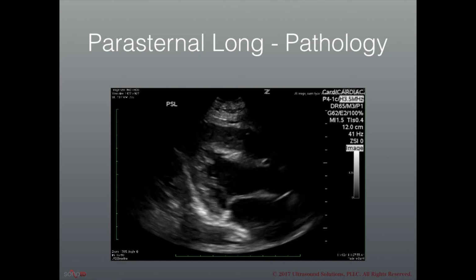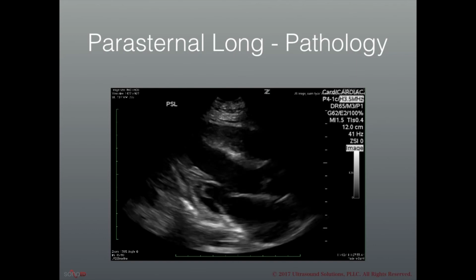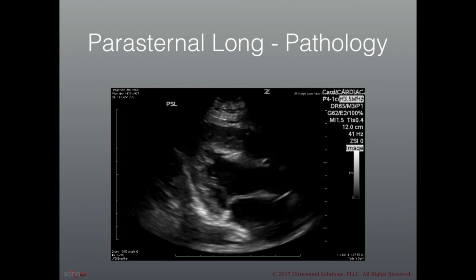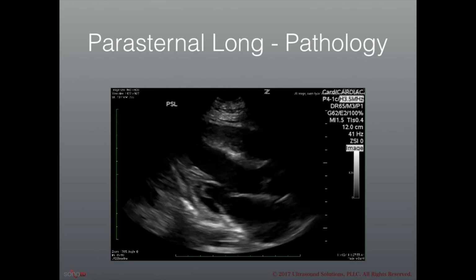Well, what I see is that in systole, it looks like the walls are almost touching. So is this a hyperdynamic heart where the ejection fraction is approaching 100%? In reality, the answer is no.